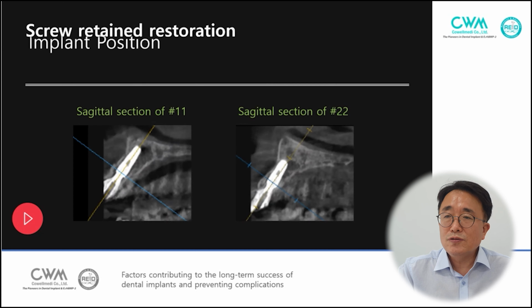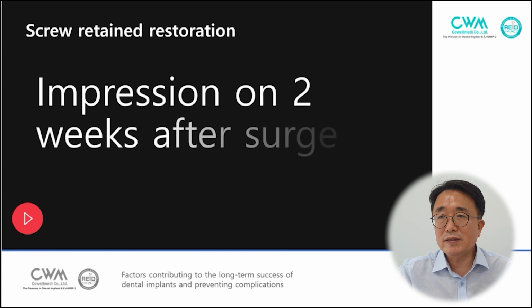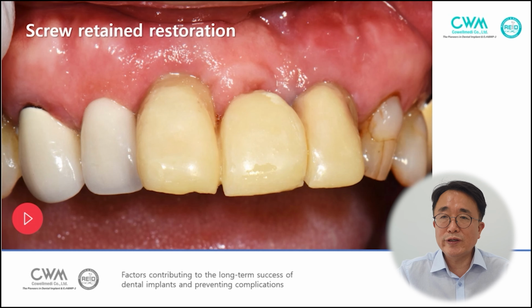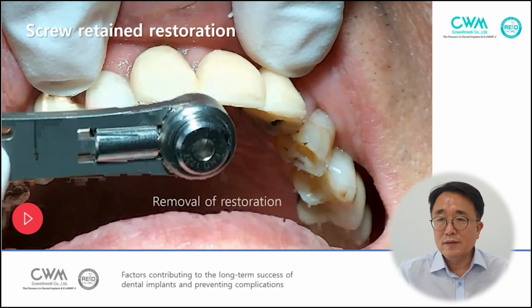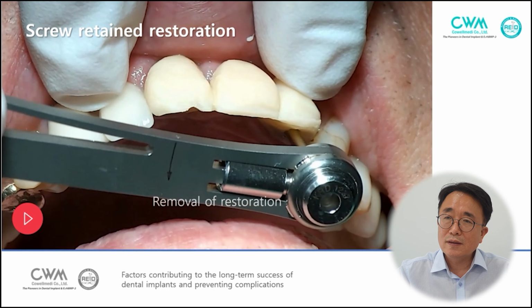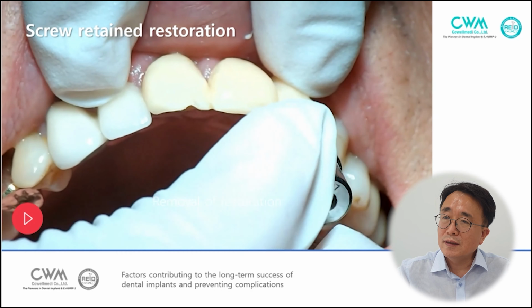We don't use cement, so there is no cement toxicity and inflammation. So I recommend a screw-type provisional restoration with immediate loading, and remove the restoration after 1 or 2 months.